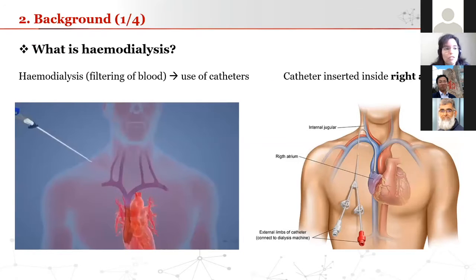So for this project, we use CFD, but what is actually the purpose? What is the problem we are trying to study? That concerns the process of hemodialysis. Hemodialysis is used for a patient when we want to help him filter the blood properly.